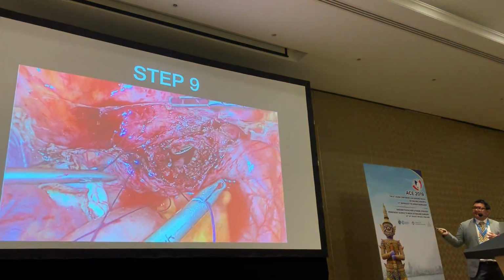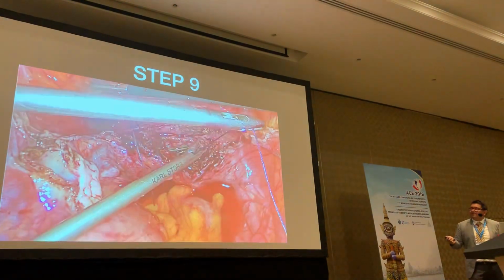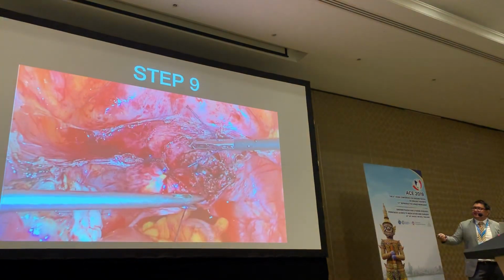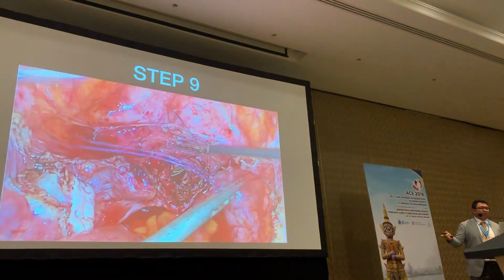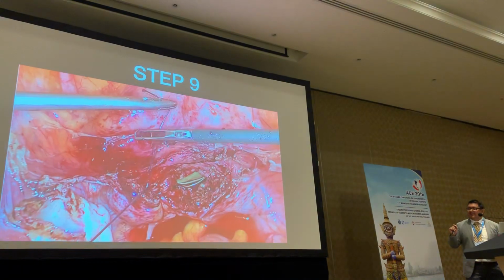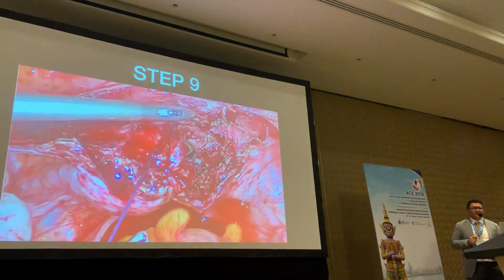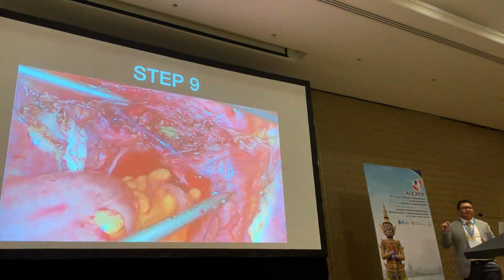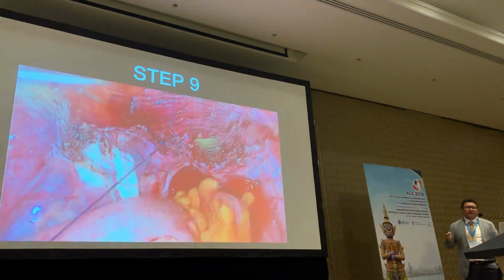So the assistant is important. Anyway, you can use multifilament or monofilament here. I use a toothed needle holder from Storz. This one was developed, but I've stopped using it because we broke the tooth of 2 of them, and it was quite nerve-wracking to find them. So now we use a different company's needle holders, which has a sturdier tooth. But it's very good for grasping the vaginal cuff, so you can get your full thickness closure.